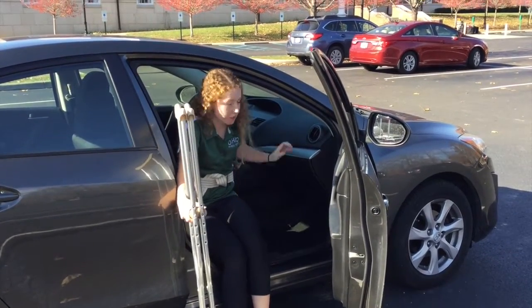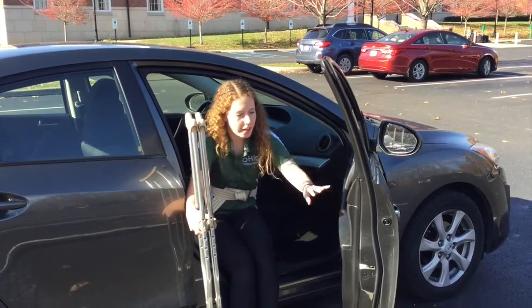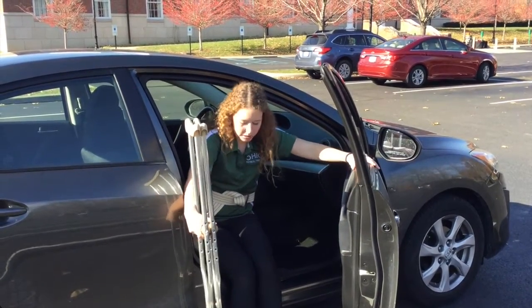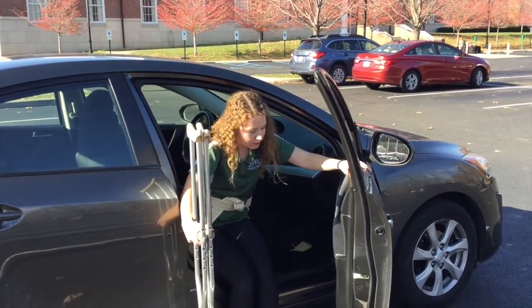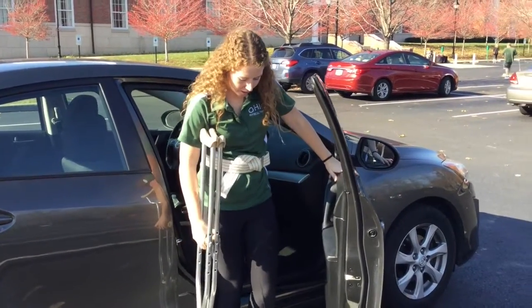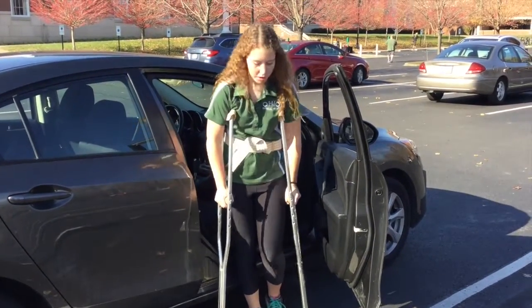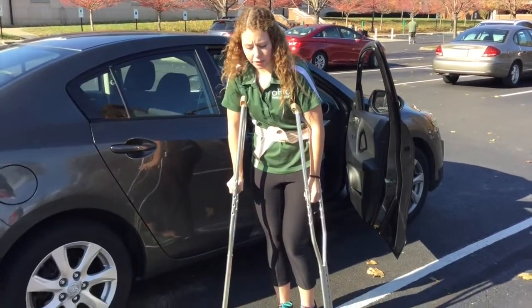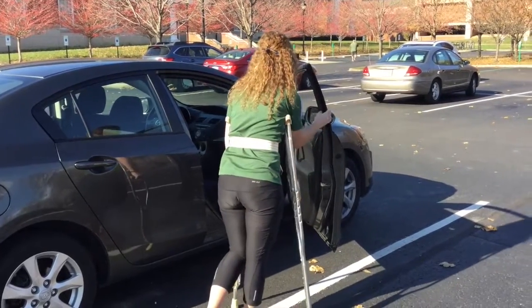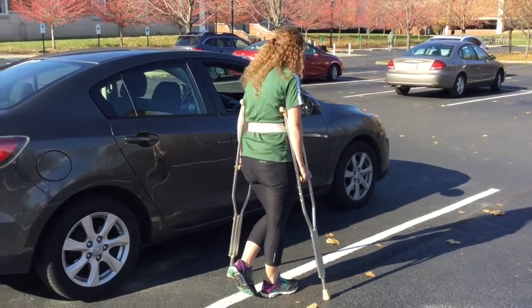And they will again either reach for the dashboard, the window frame, or the grab bar in the car door. And as they stand up, remind them to lean forward so they don't hit their head on top of the car. But they will push themselves up using their upper extremities. And then once they're raised, they will place the crutches back under the axillas and walk away from the car. And they may need to pivot again so they can close the car door. And then they may need to take a few steps backward before returning to normal gait.